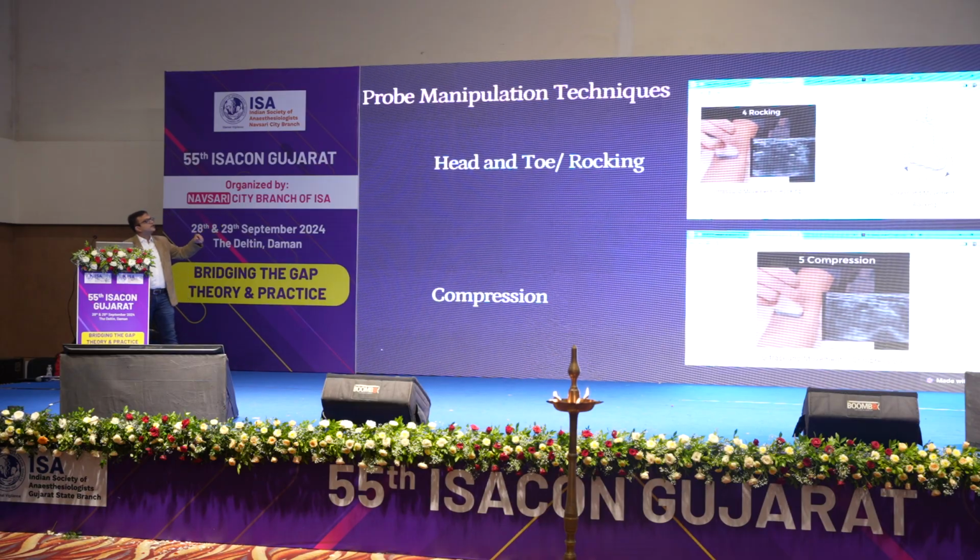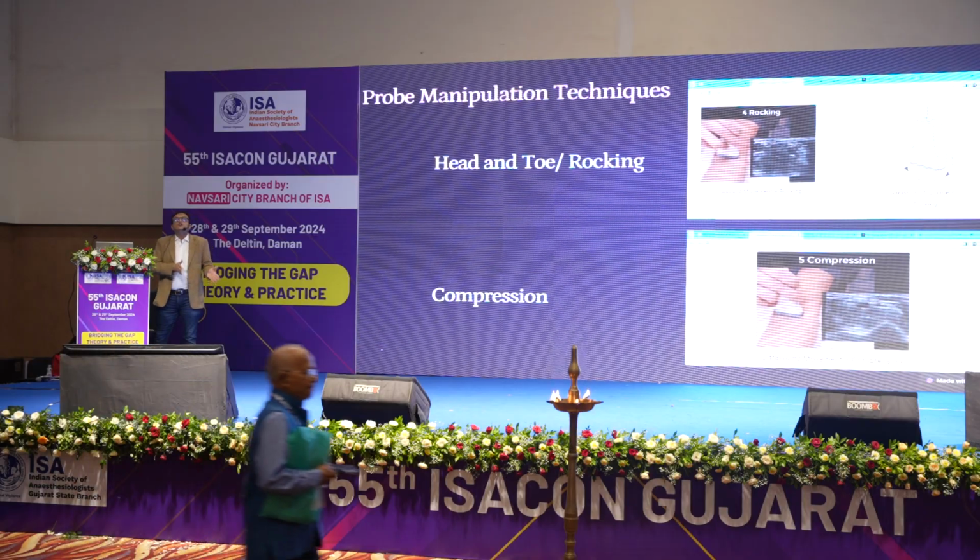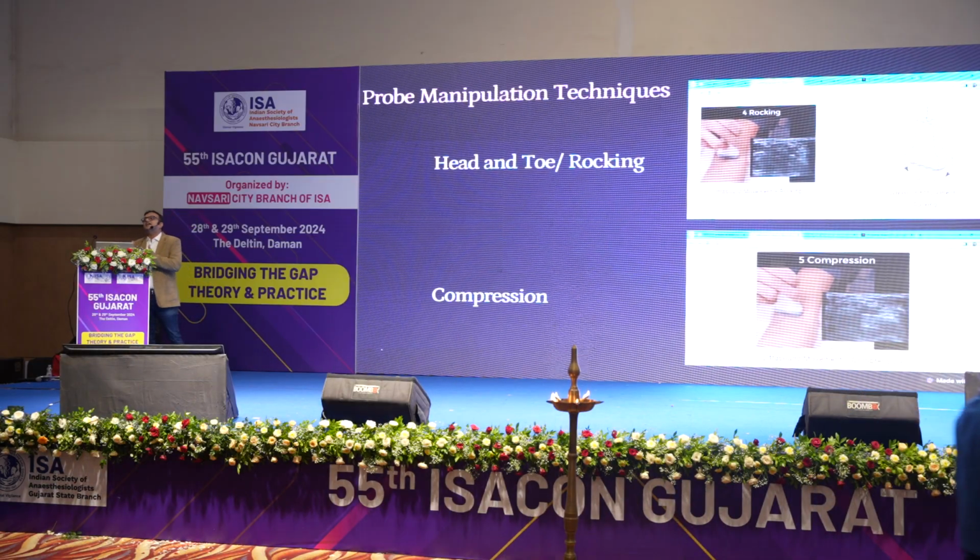What is the rocking movement? Here, you are just moving the probe. Why are you moving it? If your needle entry is far and you want to trace the needle from far, you can use that movement. And the final one is the compression movement. Compression movement is to differentiate between the artery and vein. You have to use that compression movement. So with all these movements, you can control your probe.